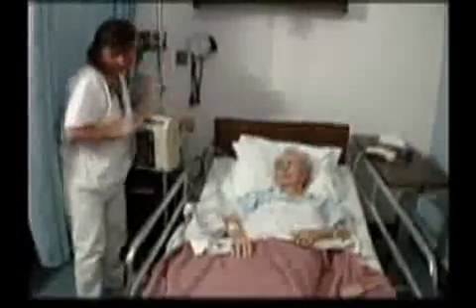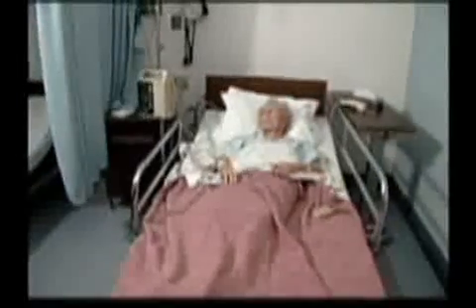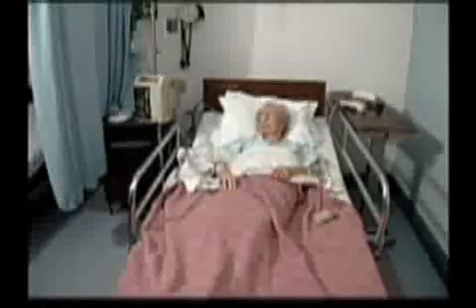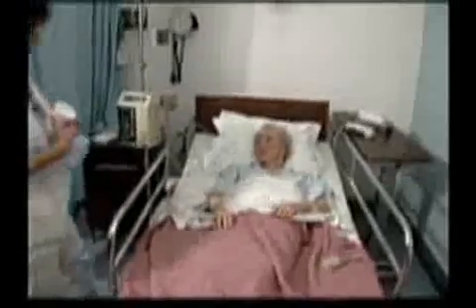Usually the physician orders a sedative, such as Valium, to help relax the patient during the procedure. If this is the case, it is the nurse's responsibility to be sure that all consents for treatment are signed before administering any sedative.